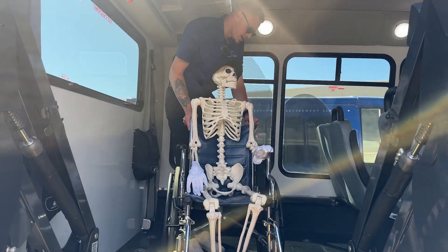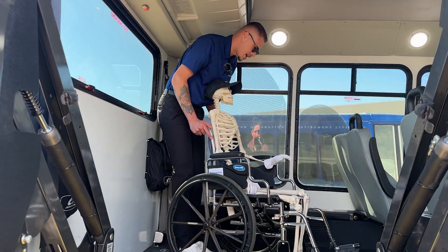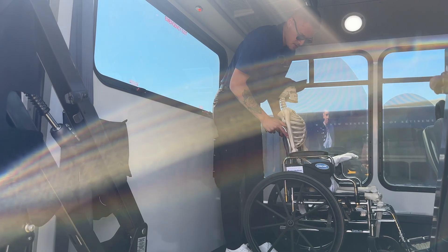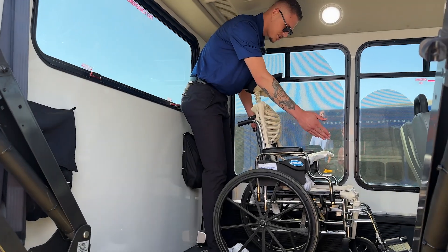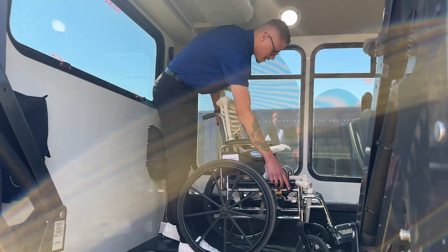Now we'll go ahead and get him set up in his wheelchair spot. He is going to be riding on the bus, which in this case will be our street side position. We'll go ahead and center him between our securements — the front ones and the rear ones — and then apply his brakes again.